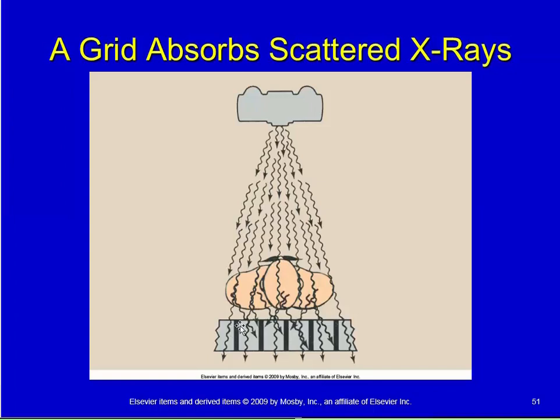So with the thinner grid strips more often, the grid strips themselves become less obvious. Since they're less obvious, and they're still made of lead, they're going to absorb most of the scatter radiation. You've thinned the strips, so you've increased the effectiveness in that respect, but you've made them less obvious on the resultant image.